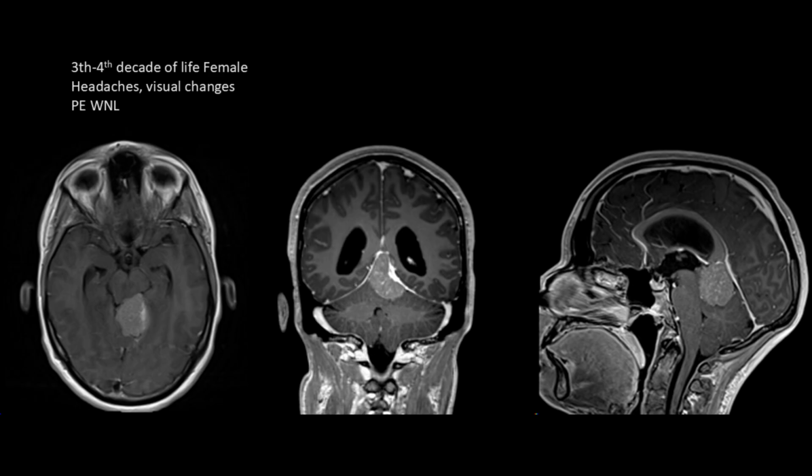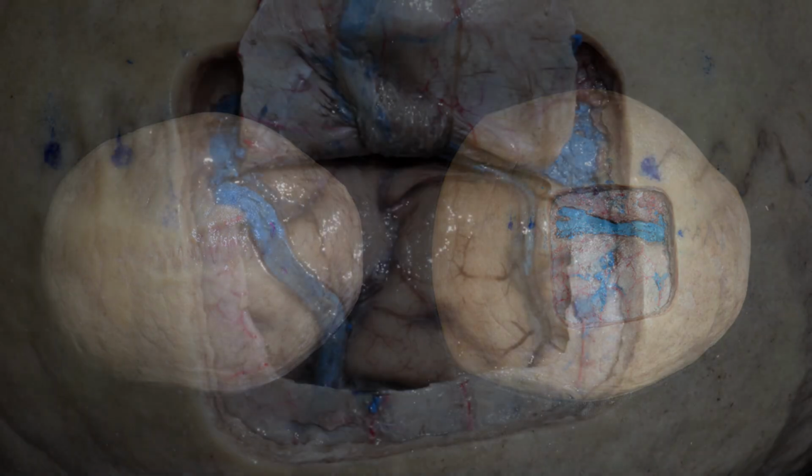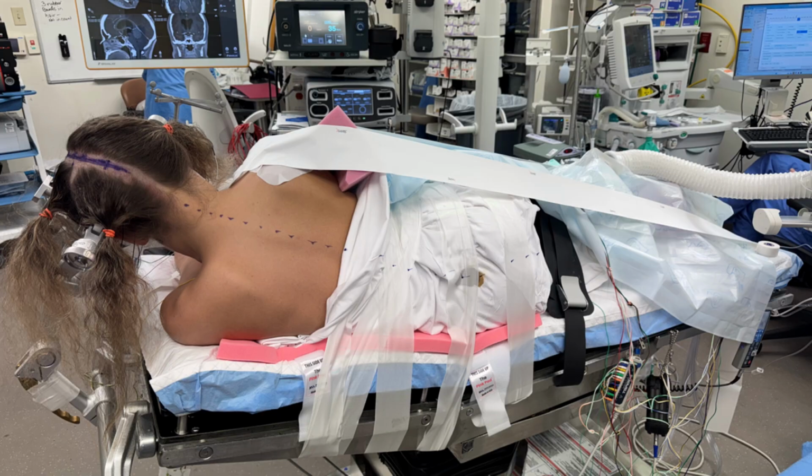We choose a superior interparietal contralateral trajectory to obtain clean access to the tumor vascular supplies and to use this natural vein-free corridor between the parietal and occipital lobes, allowing this maneuver to easily visualize the veins that are displaced by the tumor. This dissection done by our fellows shows the relative anatomy between the interhemispheric window and parietal veins that run anteriorly and medially.